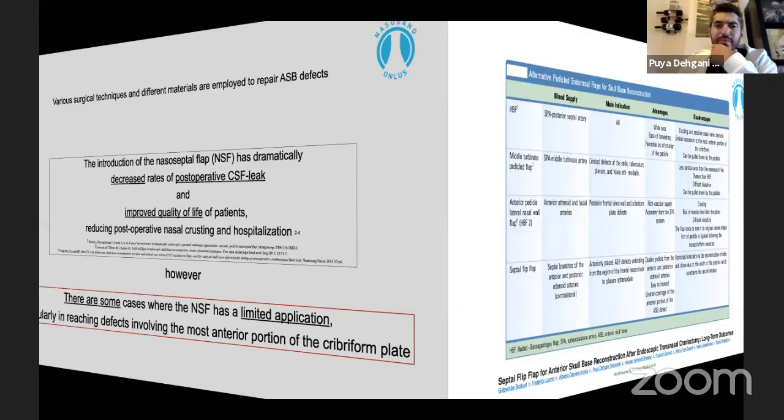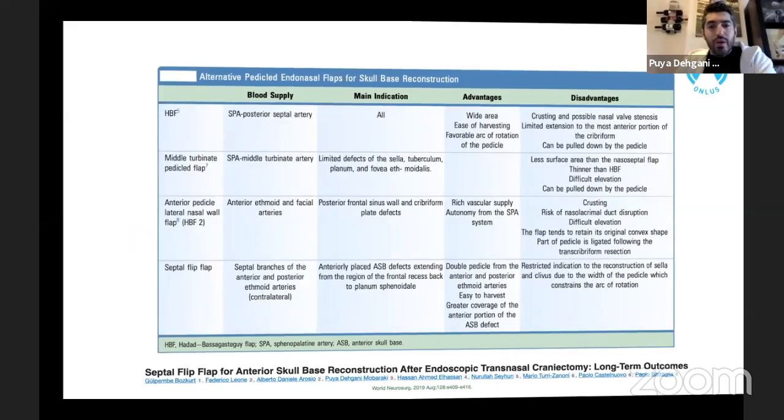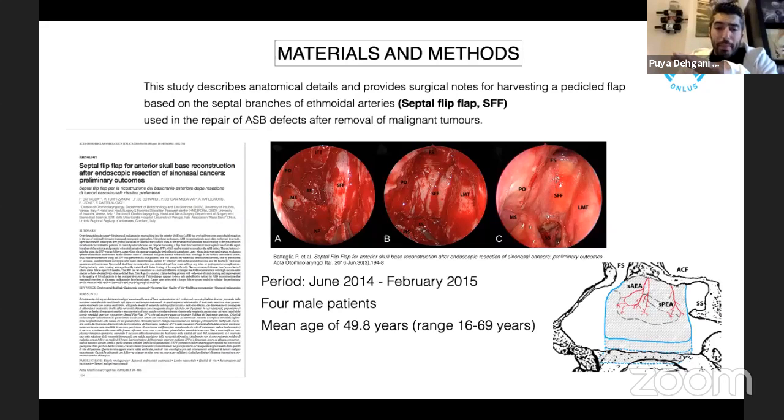So in order to address that, in the last paper that we published, we have some alternative pedicle flaps for the reconstruction, and here we are with the septal flip flap, which is based on the septal branches of the anterior and posterior ethmoidal artery. The preliminary results were published in 2016, based on a period of surgery between June 2014 and February 2015. Then we analyzed patients; there were initially 4. We had a follow-up period of 36 months with those patients.